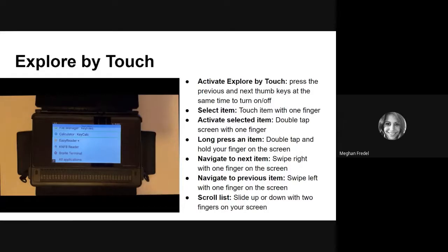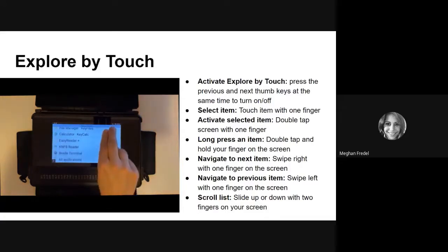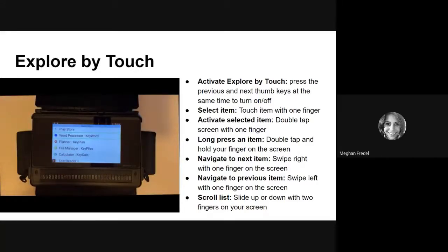Next, I'm going to demonstrate how to scroll up and down with a list. I will say this gesture took me some practice, and the best tip that I have for you all is to use a really light touch. So you're going to take two fingers and slide up or down on your screen with those two fingers. Now, if you press too hard, it's going to activate whatever item is selected, and then you'll be all over the place. So gently put two fingers on the screen and slide up. Now I'm going down. Showing items 4 to 10 of 12. So like I was saying, you have to be really gentle with how you touch the screen when you're scrolling up and down. Showing items 4 to 9 of 12. And what you'll notice when you have Explore by Touch on is that you will get more in-depth descriptions of what is on your screen, which is also very cool.